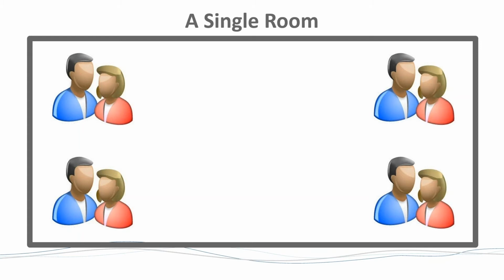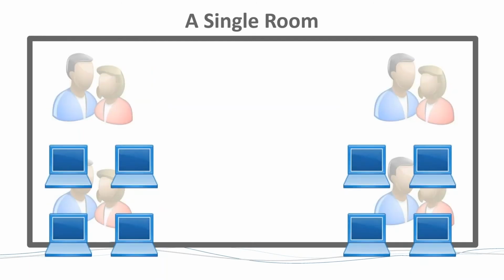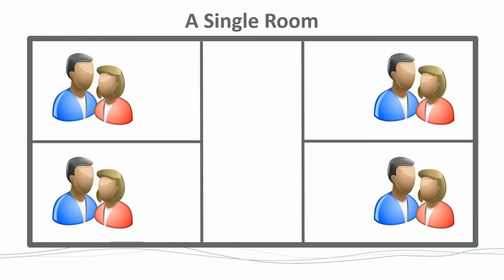From a security standpoint, I'm not going to want that traffic on the same network because one of it's highly secure and the other one, who knows what's going to happen on that network, right? So there are reasons we want to separate these out.